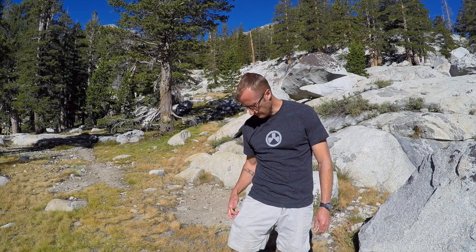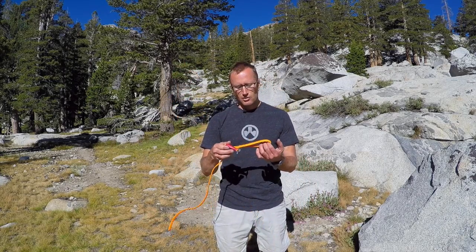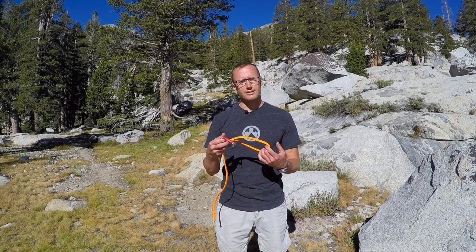Hey everyone, it's Ivan with Kipadra.com here to bring you another gear review. Today we're talking about something near and dear to me in that I carry it pretty much every day in this uncertain world. Whether I'm wearing shorts or pants, I pretty much always have a pocket down here on my right, and in that I carry a RATS Rapid Application Tourniquet.